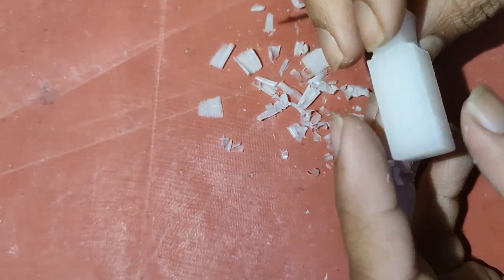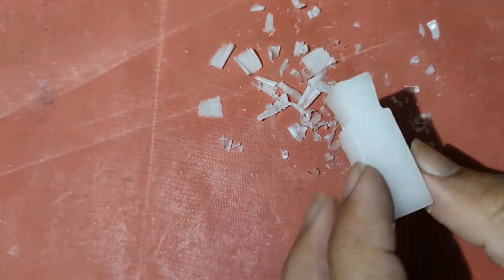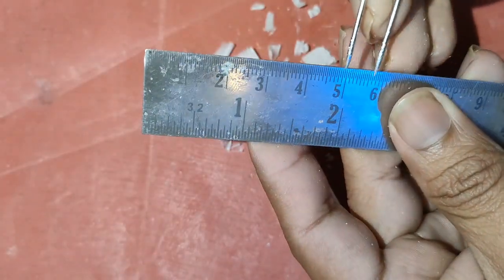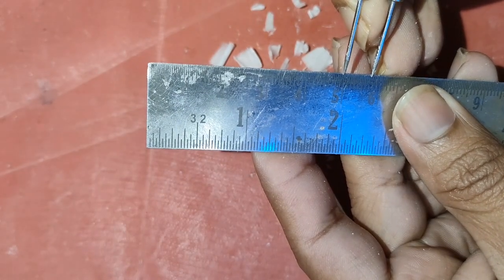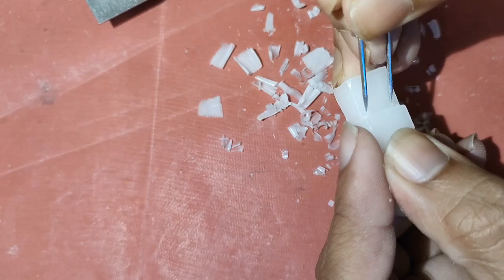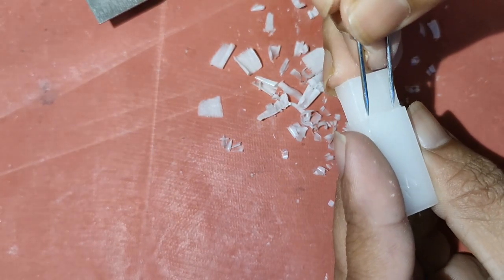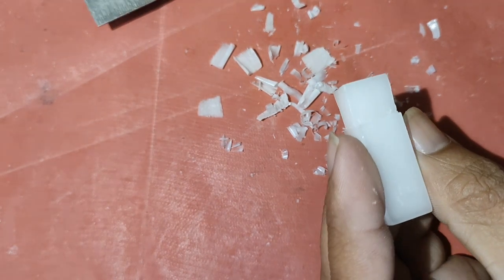Now we'll be marking the labiolingual diameter. The labiolingual diameter at the cervix is 7 mm, so we'll be taking a little more than 7 mm. Okay, it's 7.5. Let's mark it on the cervix. We'll mark it in such a way that we leave an equal portion of wax on the other side. Same goes for the opposite side also. Okay, we're done with the marking.